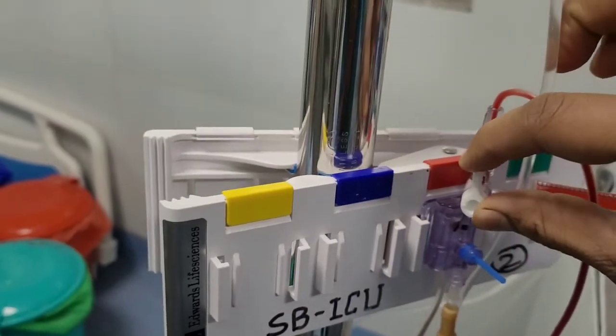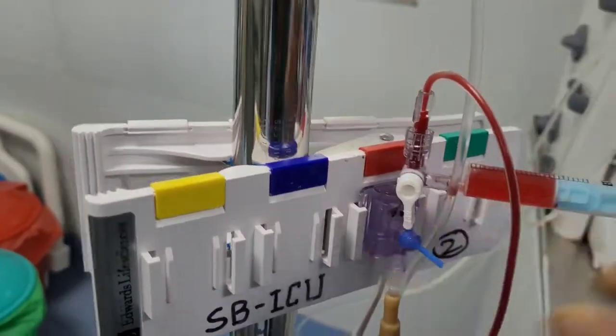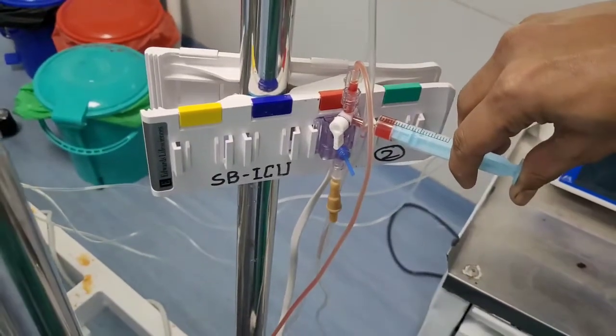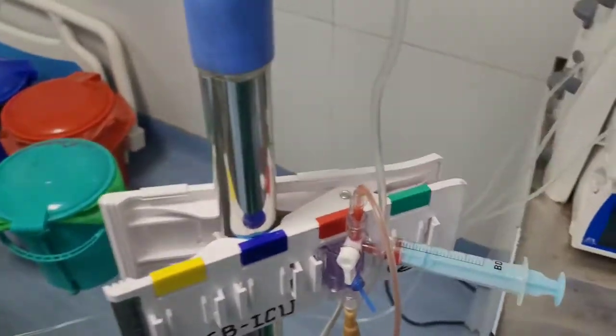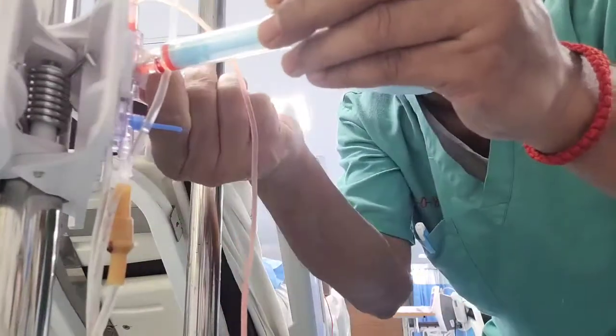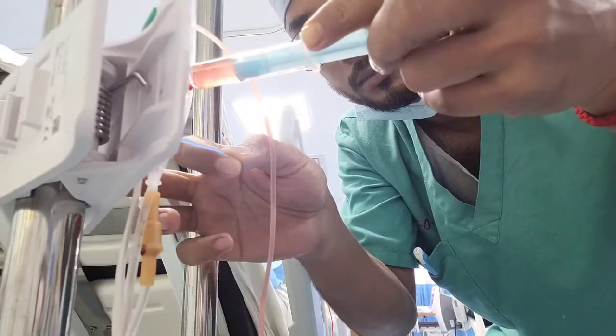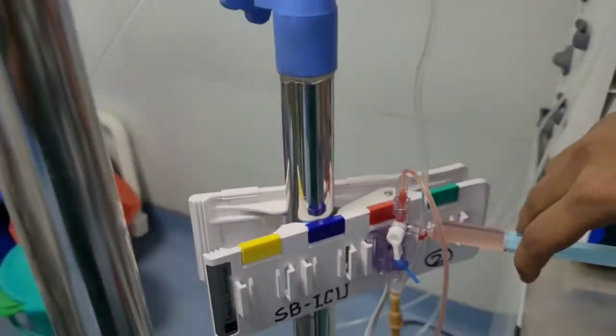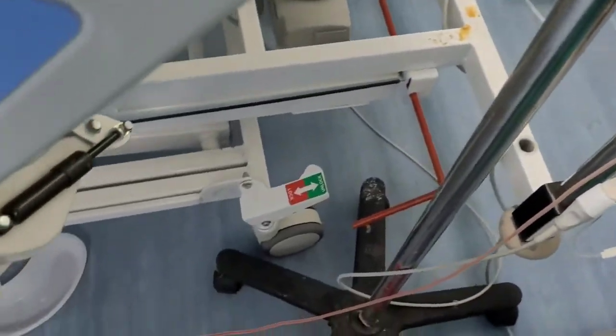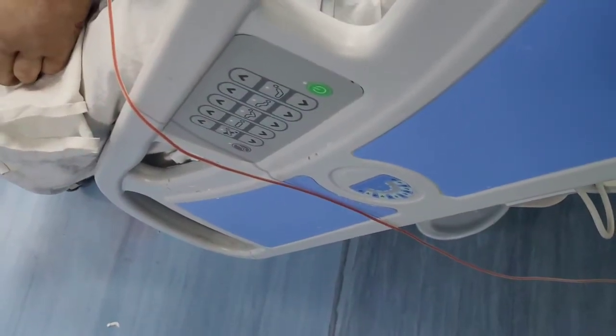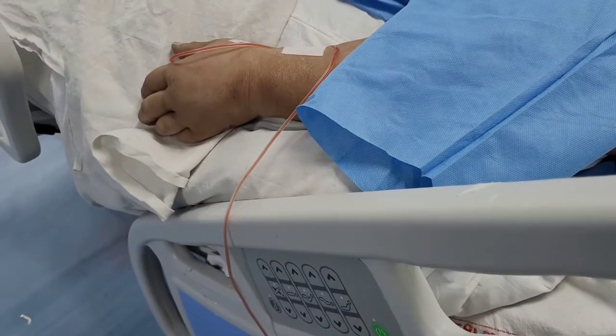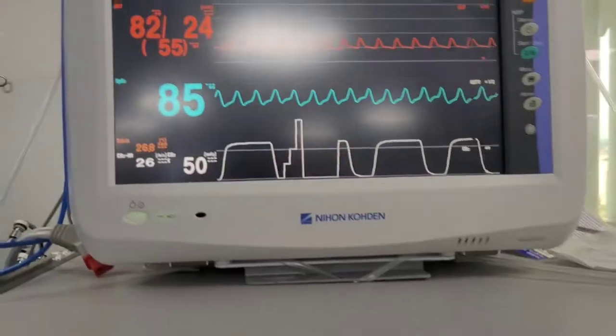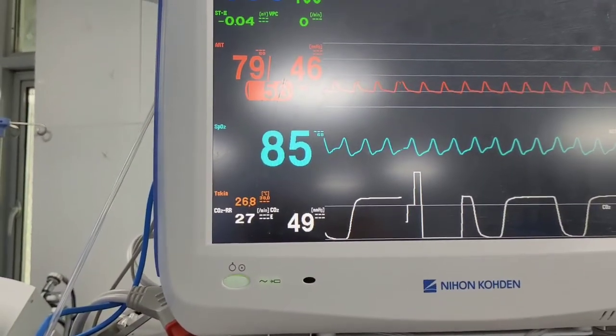Now we will turn this off this way and push flush. See how the flush is going and the blood is clearing. Now again we will turn this way, and the BP is taking the reading of invasive blood pressure.